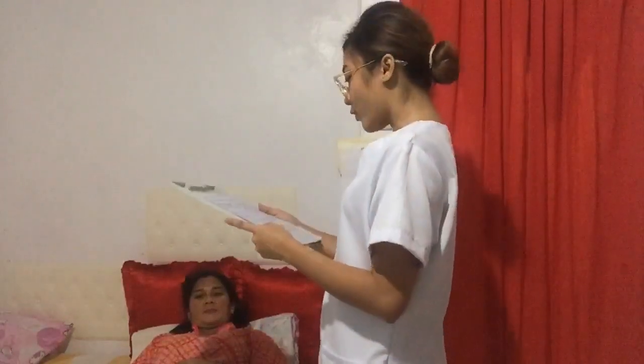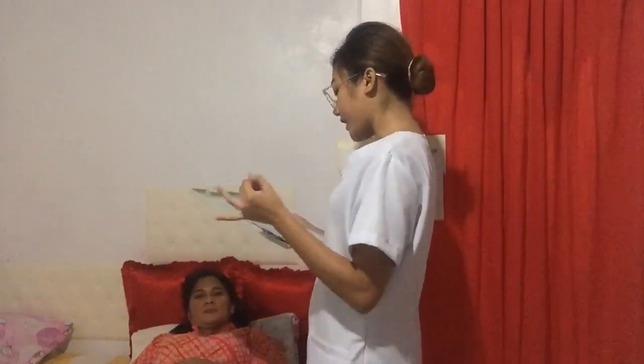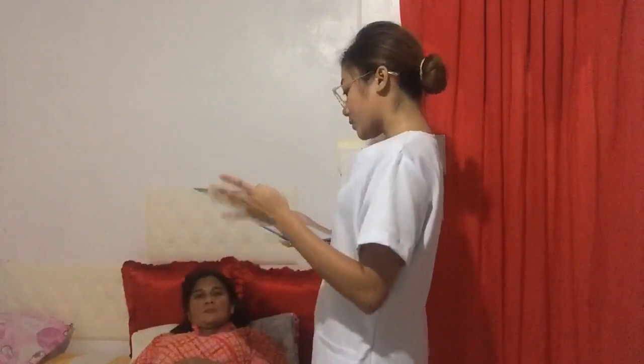I'm going to proceed to the six rights of medication administration. Okay, so you have six rights for medication administration: right patient, right medication, right dose, right time, right route, then right documentation. Then let's explain to the patient that oxygen will ease dyspnea or discomfort and inform the patient concerning safety precautions associated with oxygen use. So if the patient is using a cannula, encourage him or her to breathe through the nose.